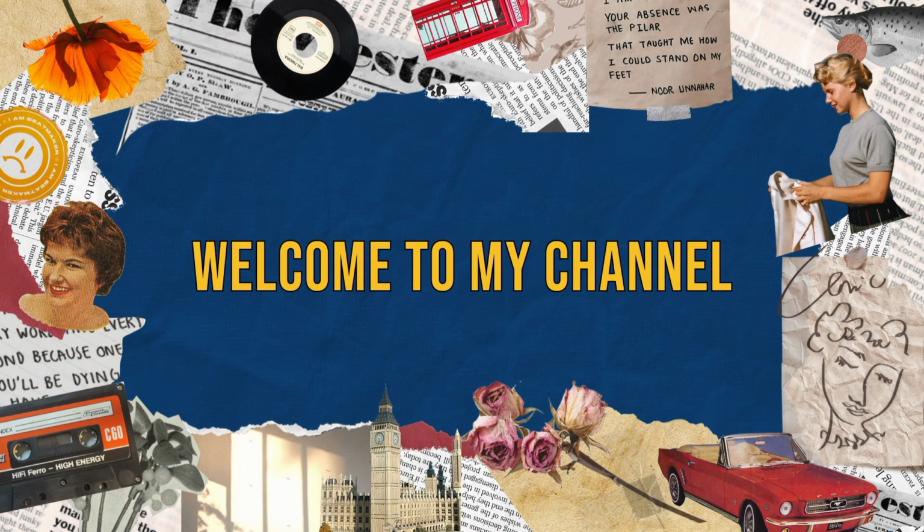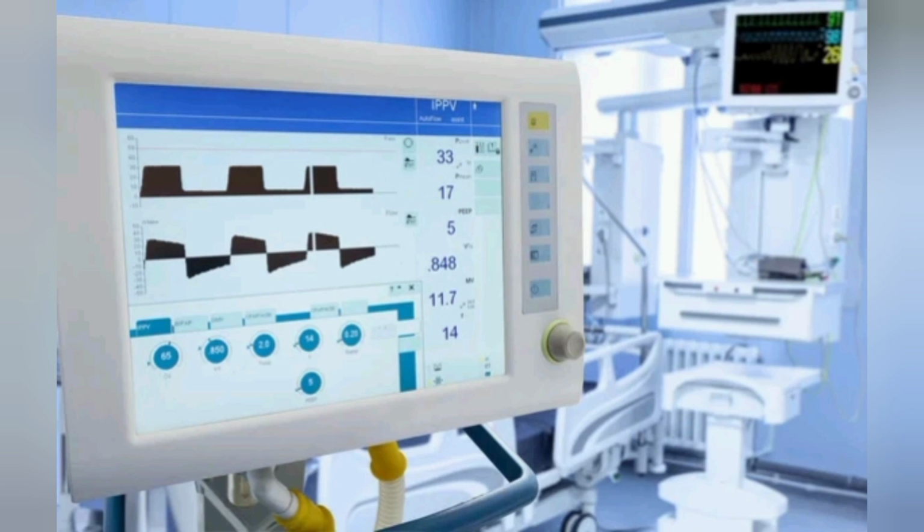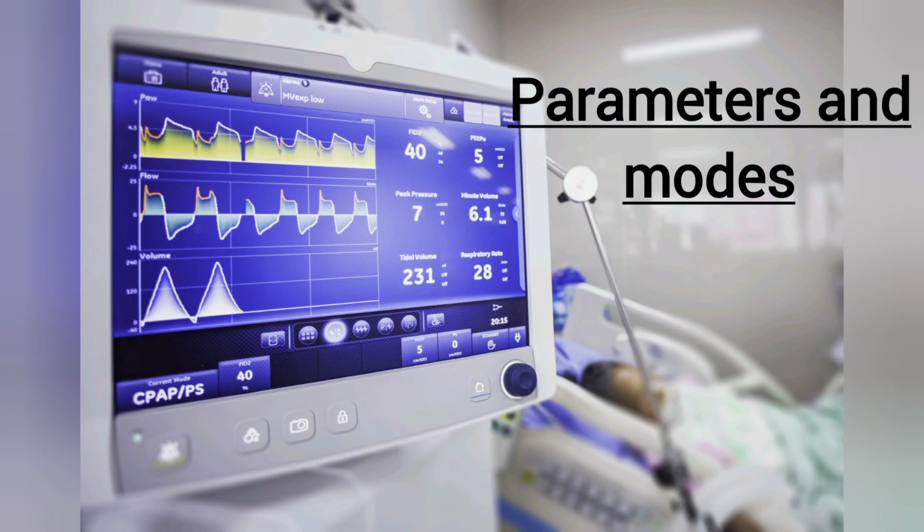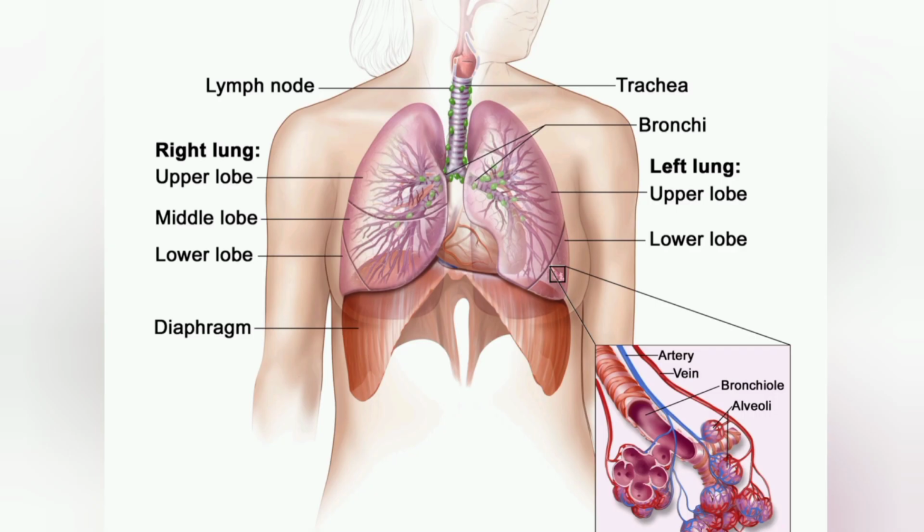Friends, today I'm going to talk on a very important topic. Our topic today is the ventilator. Basically, I'm going to explain how a ventilator works, and very importantly, I'm going to explain the parameters and modes of the ventilator. As we all know, our lungs are the key for gas exchange in our body.